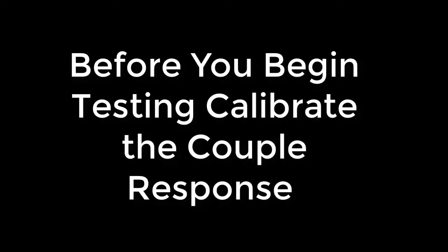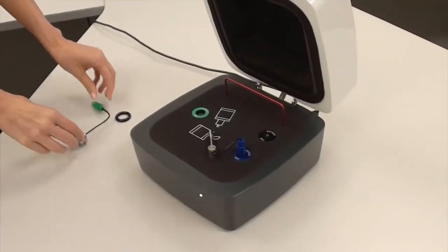Before you begin testing using the HIP box, you should calibrate the coupler response.